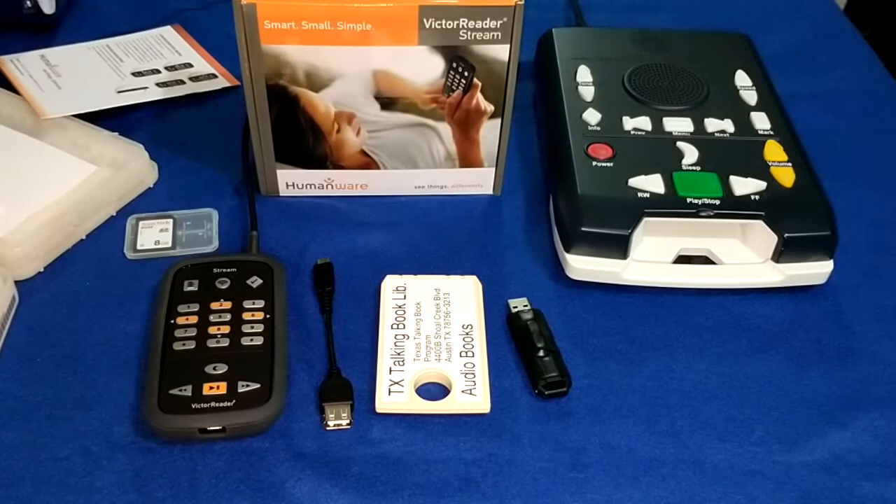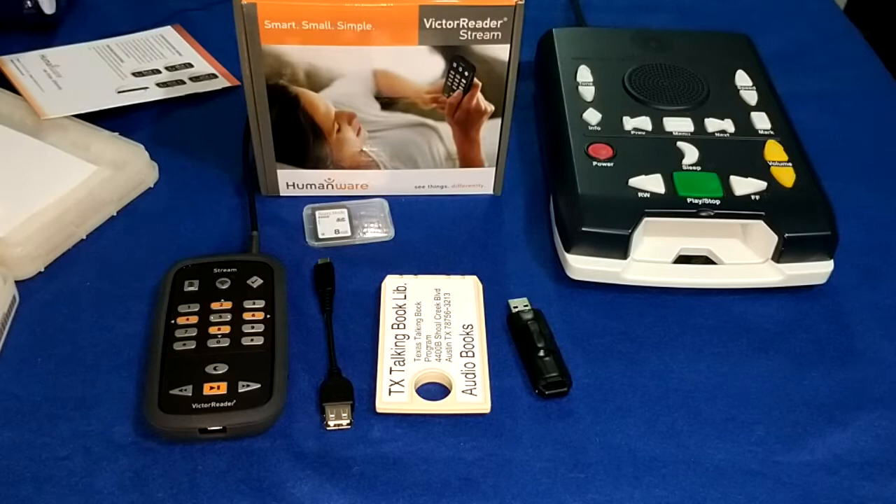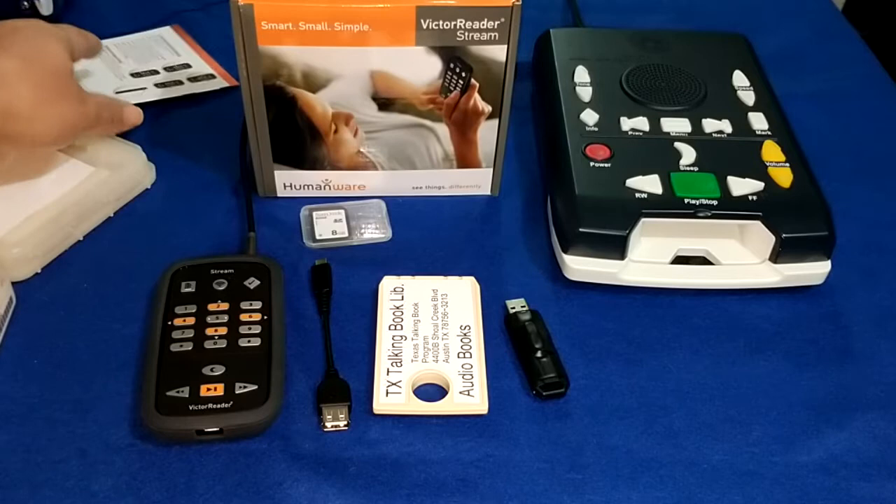Hello everyone, it's me Sam here once again with another video on the Victor Reader Stream. I did an unboxing on this device, so we did that. I'm going to make some corrections real quick from that last video, and then we're going to get right into it. The actual topic of this video — this is somewhat of a tutorial and I don't find too many videos on this, so I decided to make one.